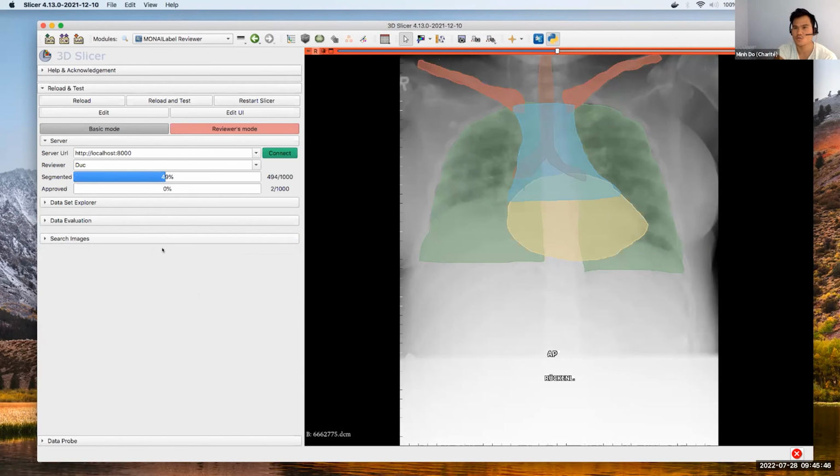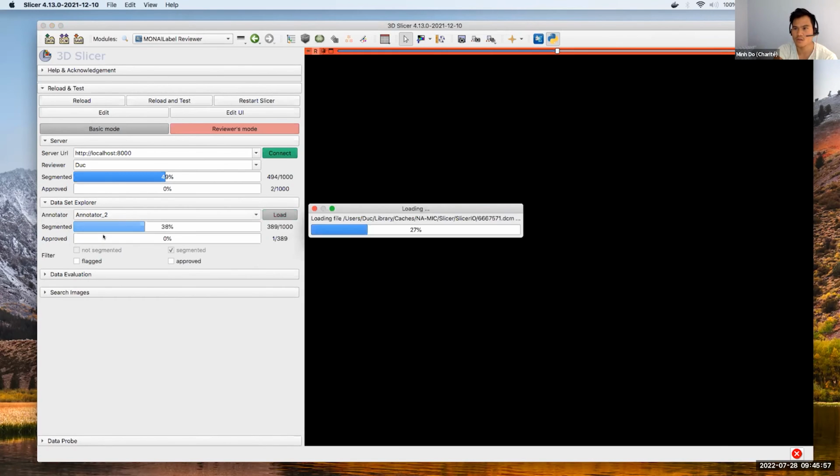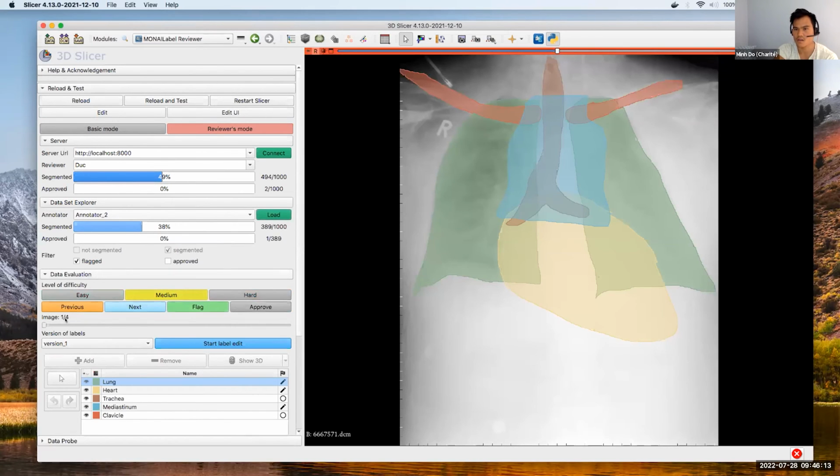Yes, those are the main functionalities of our tool. And what I haven't shown so far is that one. Exactly, if you initially just want to see the images of annotator _2 and browse through them, it will load the entire data set. And now you can pre-select the filters again here, just like the approved ones or the flagged ones. And then you have to click on load again. And you see again in the horizontal slider, here are 4 images which were flagged by the segmentator.